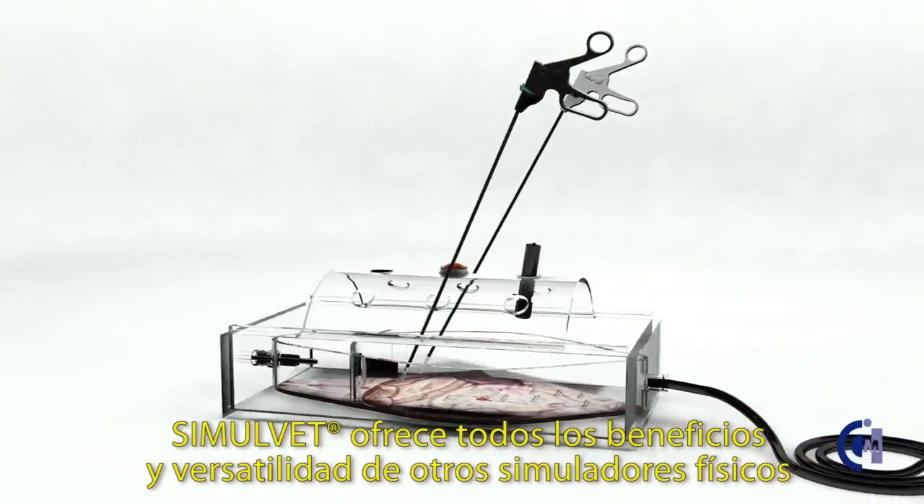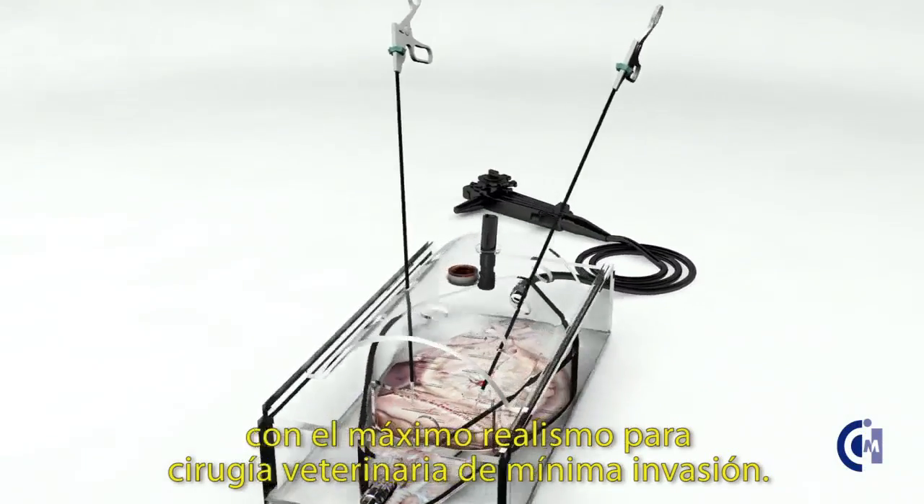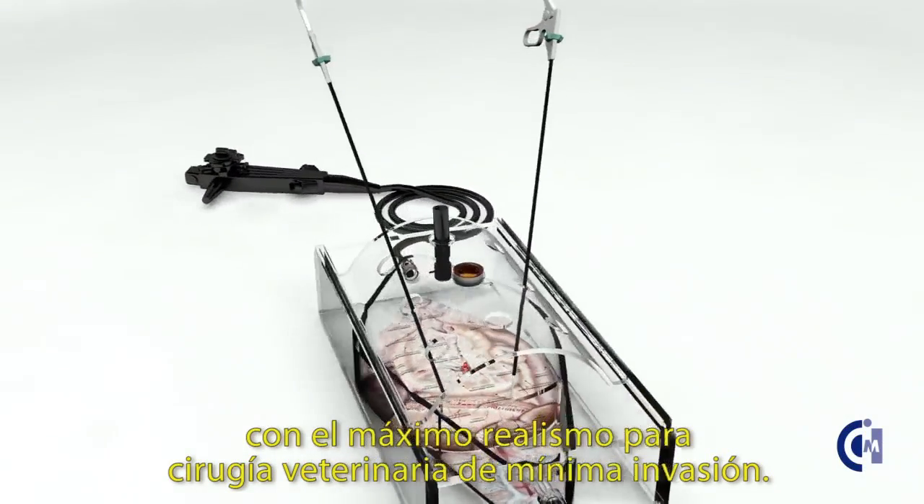SimulVet provides all the benefits and versatility of other physical simulators with simultaneous maximum realism for veterinary minimally invasive surgery.